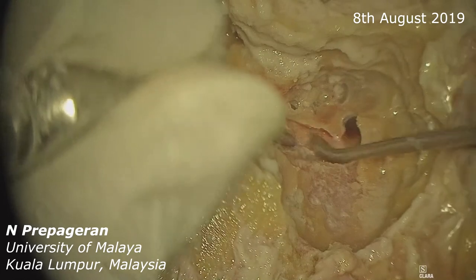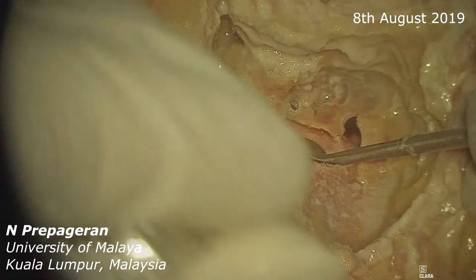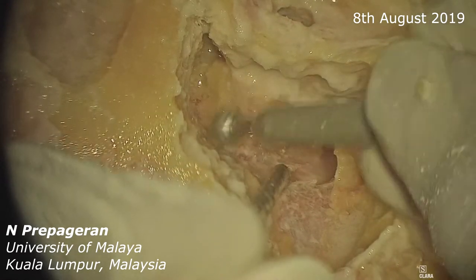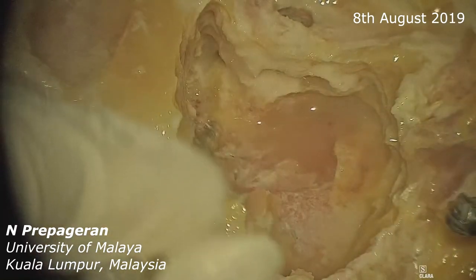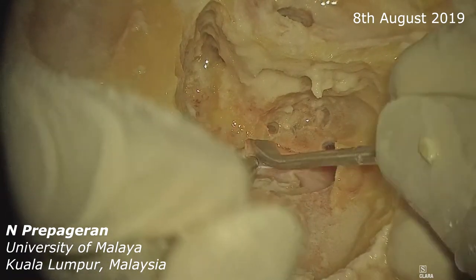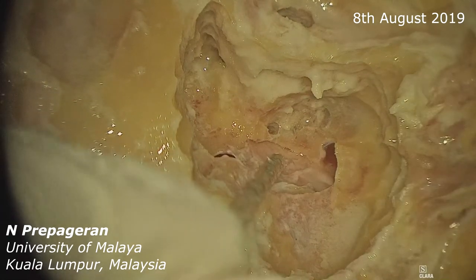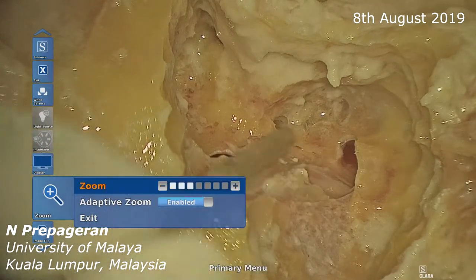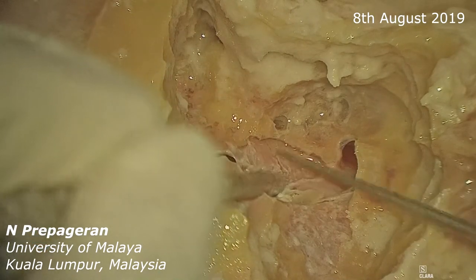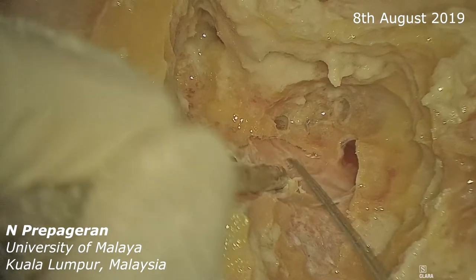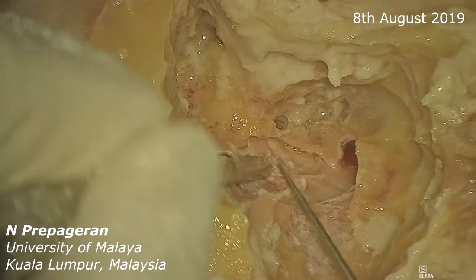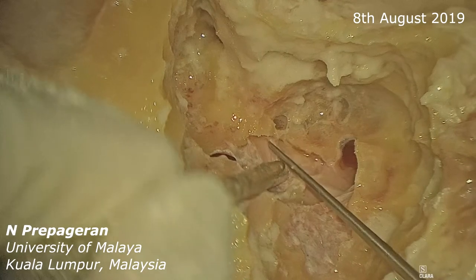So now what I would like to do is dissect the pre-sigmoid a little bit more, and then we can see the endolymphatic sac. And that's the endolymphatic duct — you can see where the duct is entering. Let me drill a bit more, going higher, a little bit more of the sinodural angle. We can dissect a little bit more — that's the endolymphatic duct. We can actually open up the endolymphatic sac by using a pick. This is the endolymphatic duct here, and you can actually open up the sac like this. That's the endolymphatic sac.